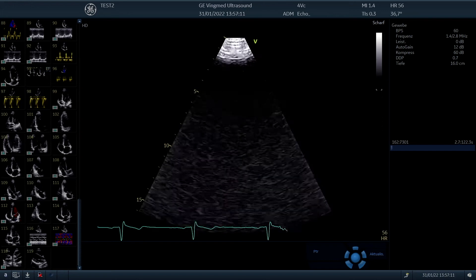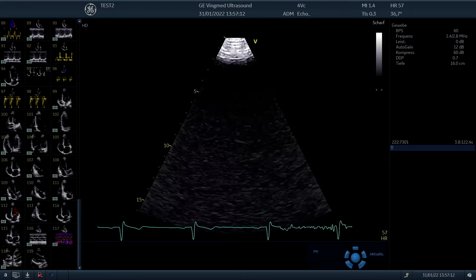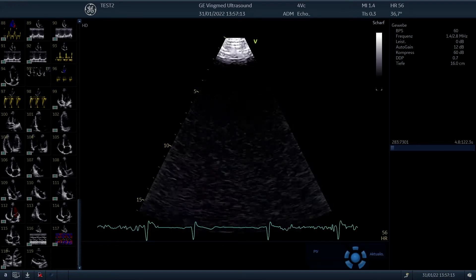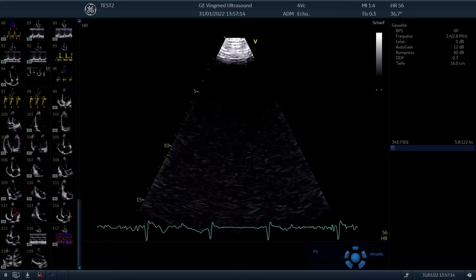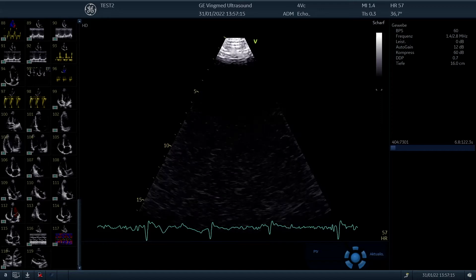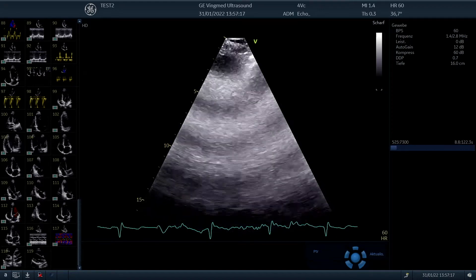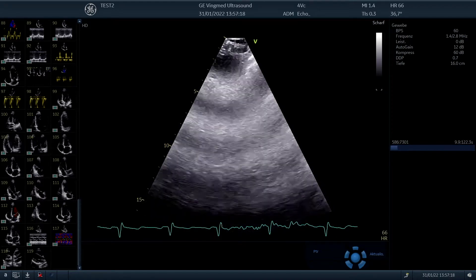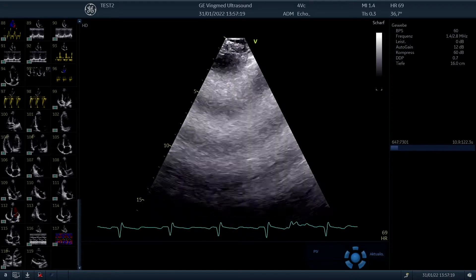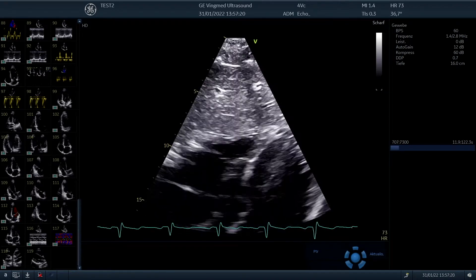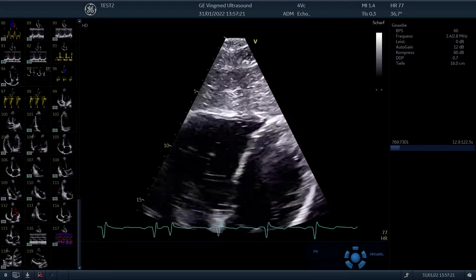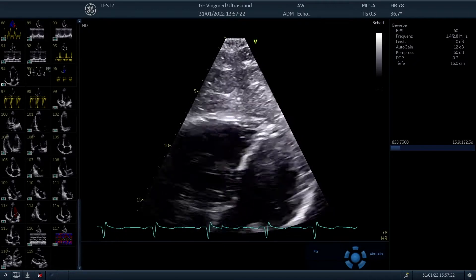The next views we are going to acquire are the subcostal views. There is not only one view, as you might know — there are several views. We start with the subcostal four-chamber view.